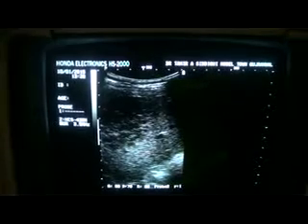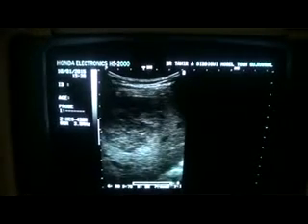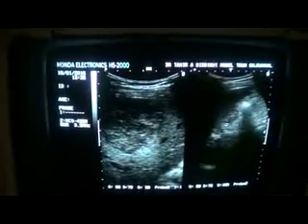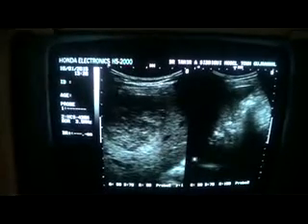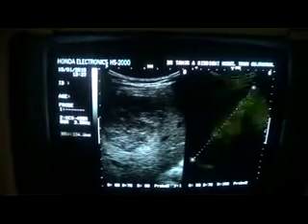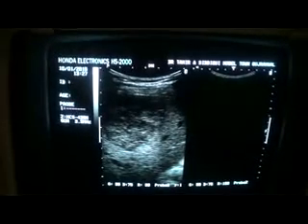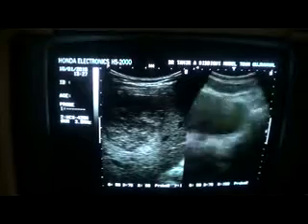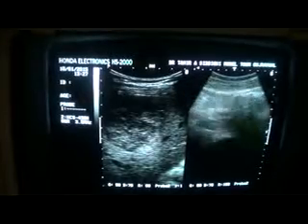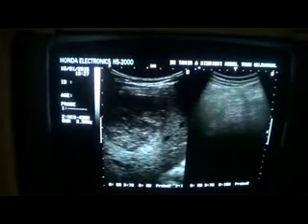It will be better if we also see the spleen, because in systemic infections the spleen will be enlarged, but in this case the spleen measures only 12.3, up to 12 is normal, so this is a case that is not complicated by other findings. See if there is any fluid in the dependent region, peritoneal cavity; any ascites associated with it should be seen. There is no ascites seen.